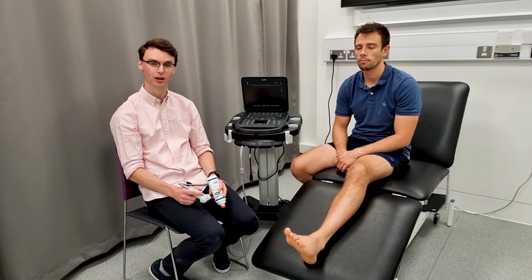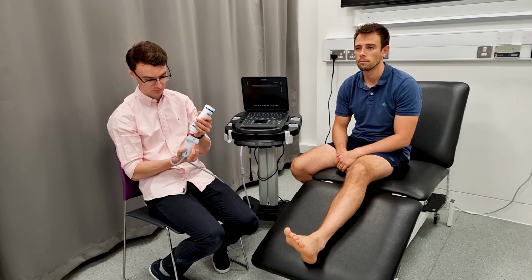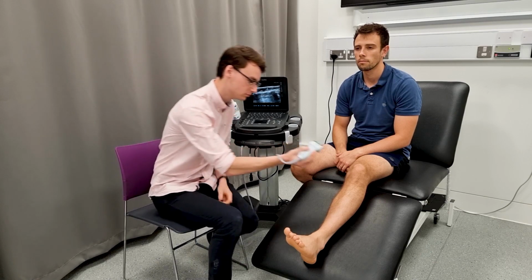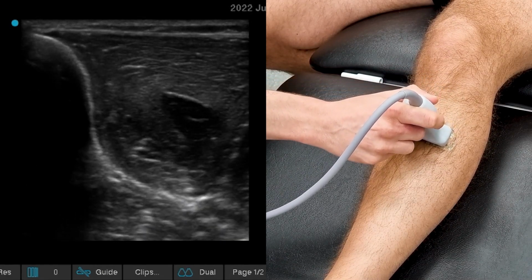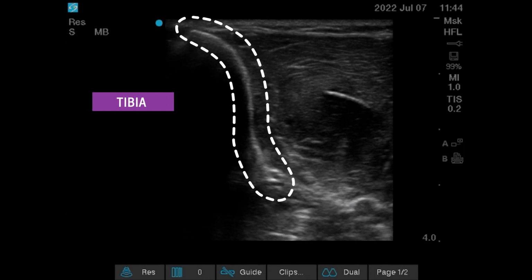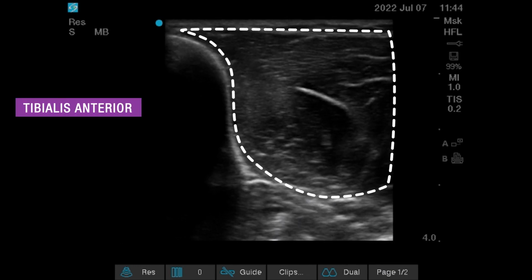Finally, we're going to demonstrate ultrasound of the anterior leg and the ankle. If you place the transducer on the anterior leg, several structures come into view. The bright white line in the corner of the screen is the tibia. We know this as the tibia is a bone and ultrasound waves cannot travel through it. The rest of the image is muscle.